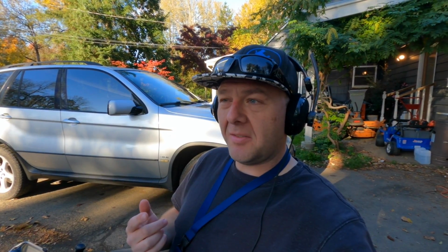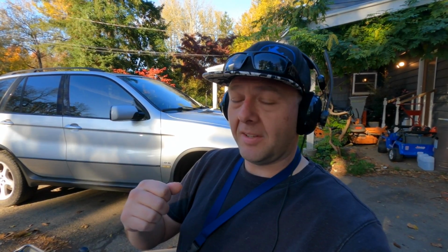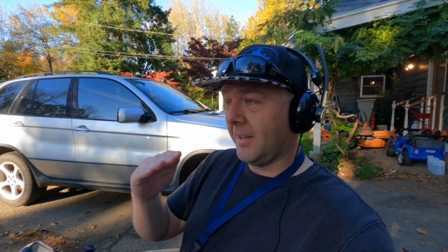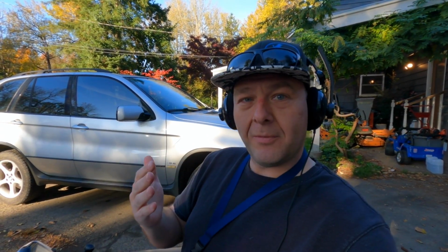I apologize I don't have any footage of me actually using it. I did figure out though that even though the foot plates are mounted to the base of the chair and the chair does tilt, when I first hopped into it, the leg rests seemed like they were pretty short, but then I realized all I had to do was tilt the chair back a little bit, since I do normally run around with a bit of tilt on my chair, and then they were the perfect length.